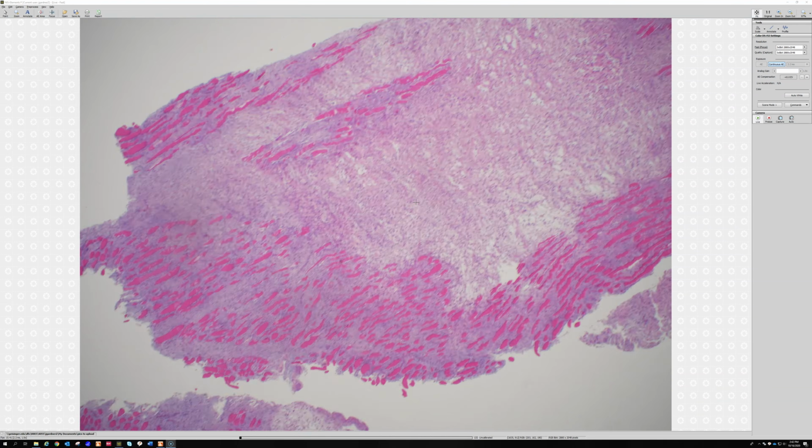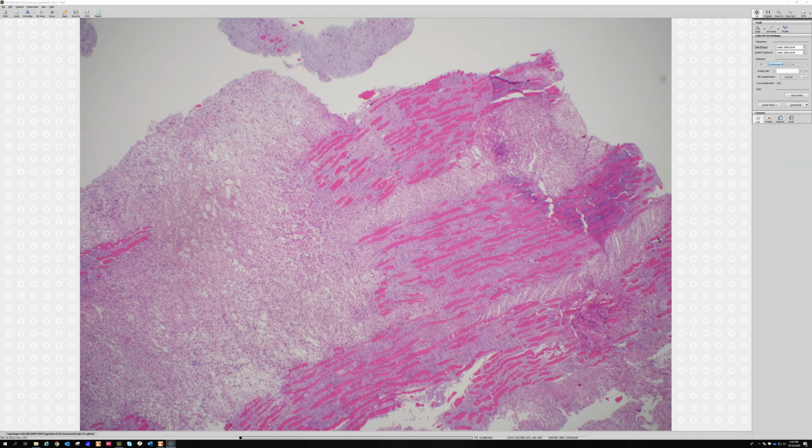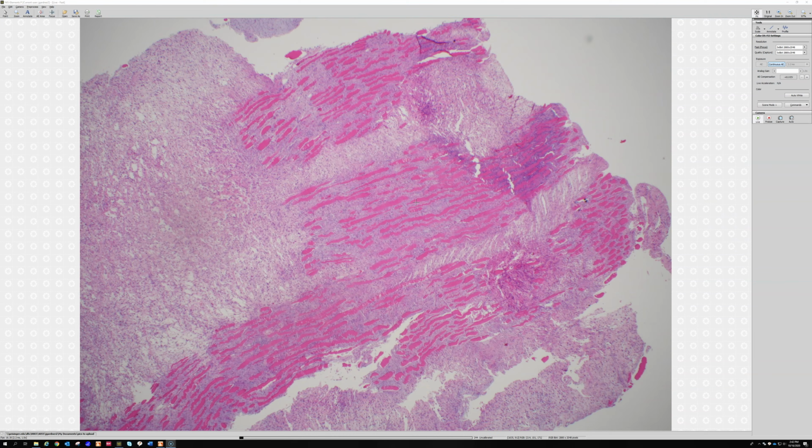The proliferative fasciitis or myositis, when it's in the muscle, it splays apart each individual skeletal muscle fiber and whole groups of fibers, and that is an uncommon pattern for sarcomas to do. High-grade sarcomas usually grow rapidly and push everything out of the way. They make like a big ball of tumor and have actually smooth, not infiltrative borders, with a few exceptions. One of the most notable exceptions would be myxofibrosarcoma.